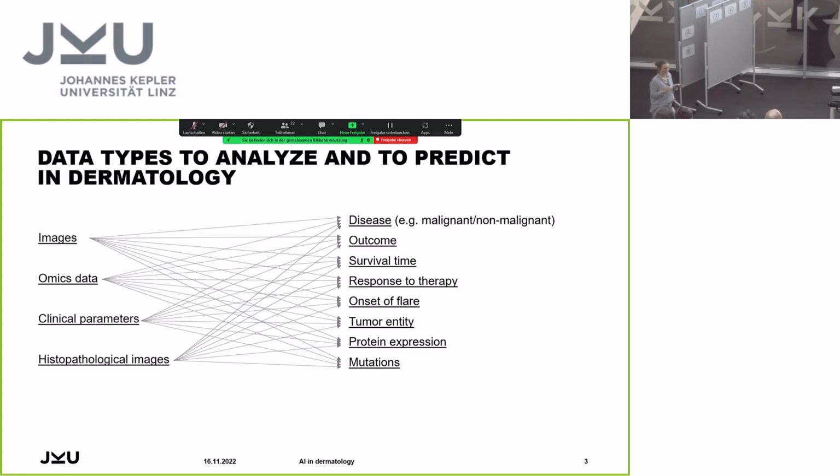I want to explain in short what that is. Histopathological images are made when something is excised from your body by a surgeon, or you get a biopsy of the skin. This goes to pathology, where they create very thin slices of the tissue, put them on a slide and stain it so that each cell is visible for the pathologist and he can make a diagnosis. And this is actually the kind of images we are working with.